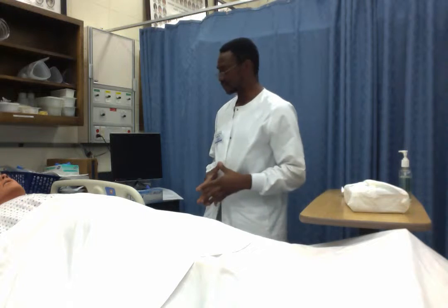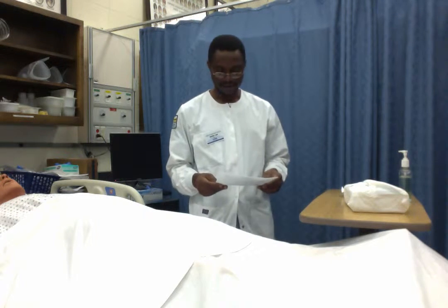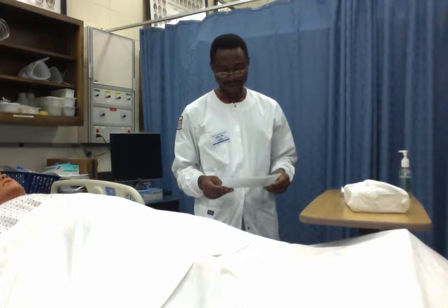My name is Eric Denning, and I am here to insert a Foley catheter aseptically, following the aseptic procedure. Before I begin the procedure, I will start by verifying the physician's order. According to the physician's order, I am supposed to do this procedure at this time.